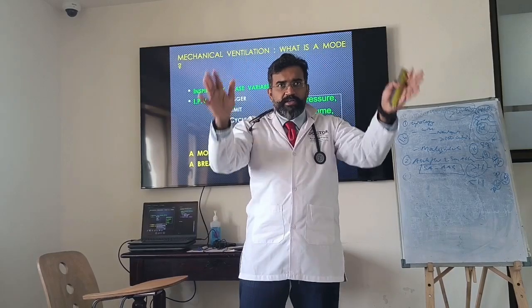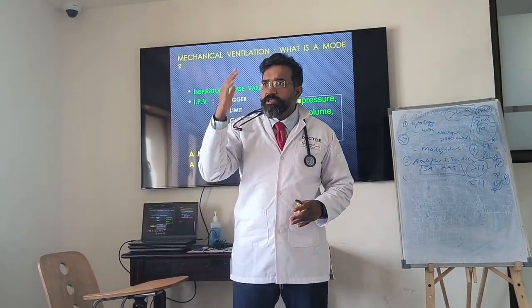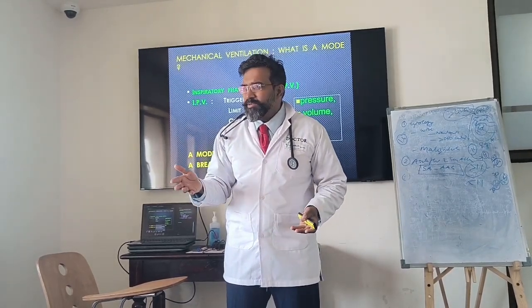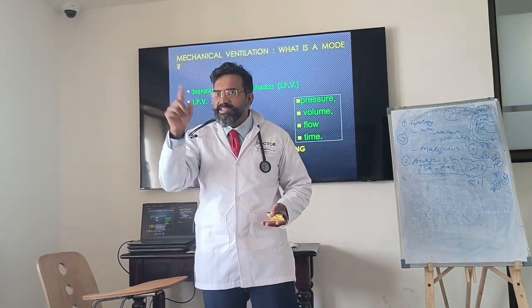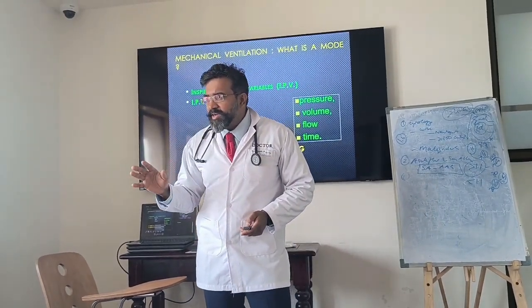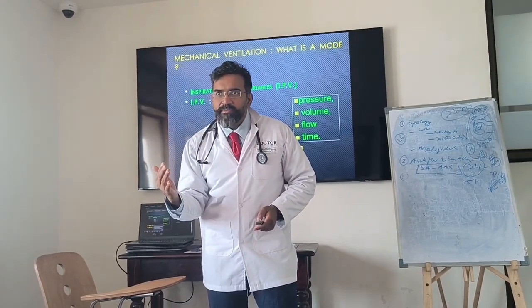So on my monitor ventilator, I need to see the variables. So when I come on my rounds and I don't see the variables there, I realize that you have not seen the ventilator. I don't tell you, but I know you have not seen the ventilator. Because if I want to see the ventilator, I know what I want to see. Then I change everything before I go. And then on my way out, I'm walking and say, oh, okay. One glance, I know it's fine. Understanding? So the variables have to be seen or monitored on your ventilator.